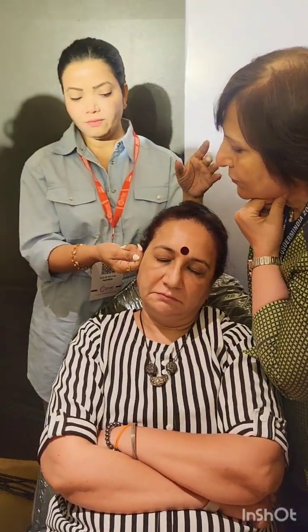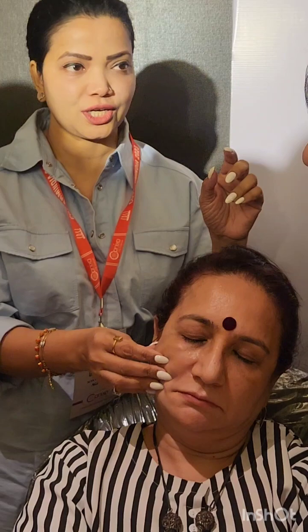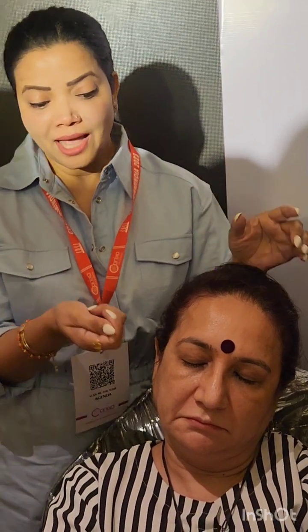Right? If you are deeper, how will you get to know? While advancing your needle, we'll keep checking, we'll keep lifting the needle so that it will show you that you are in the right way. If you are able to lift, because of the cellular structure of the subcutaneous tissue, that means you are in the right way. That's a good marker for you.